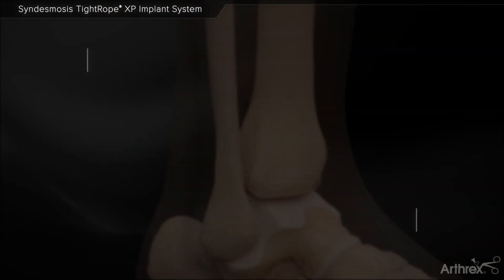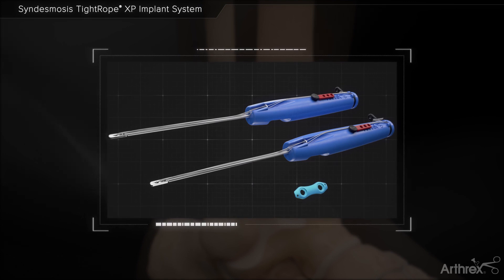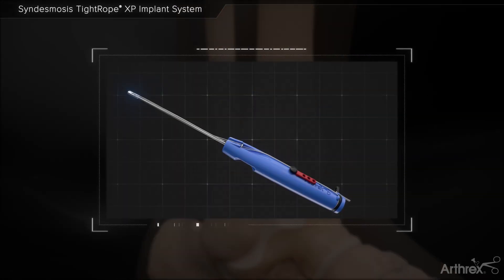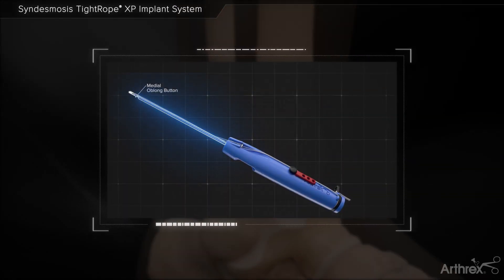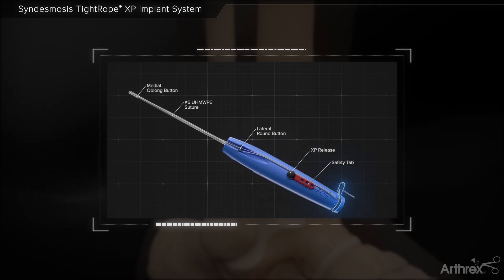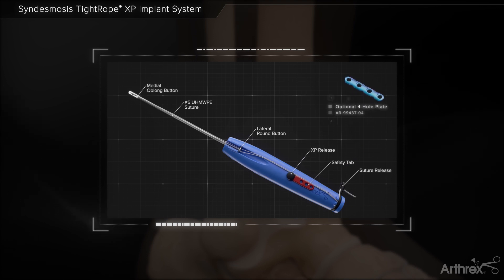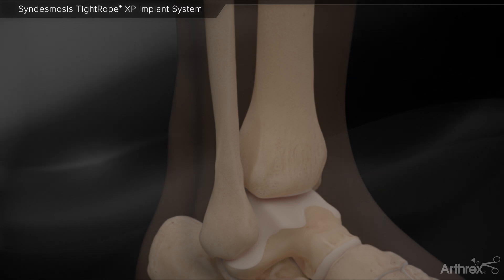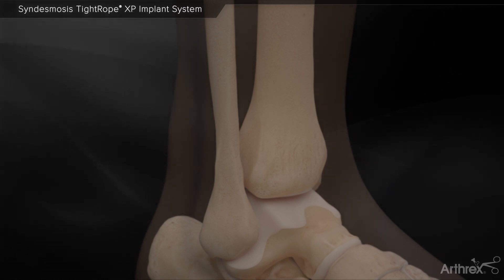Isolated syndesmosis injuries can be treated with a minimally invasive technique by using two syndesmosis tightropes and a buttress plate. The Syndesmosis Tightrope XP implant system features a unique delivery mechanism that allows the user to insert a syndesmosis tightrope implant without pulling a needle through the medial skin. The XP gives the user control to flip the medial oblong button below the skin for less soft tissue interposition.